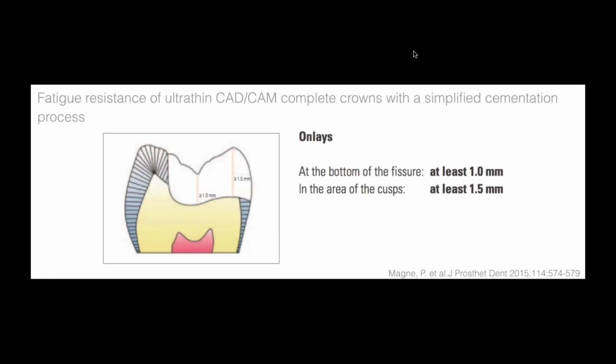And of course, these materials are not very strong in nature, so they rely on two things. They rely on minimal thickness and also on adhesive cementation. For these types of materials like VITA Dynamic or feldspathic ceramics, that need to go through a bonding adhesive cementation process, that's a key factor for the long-term clinical success.